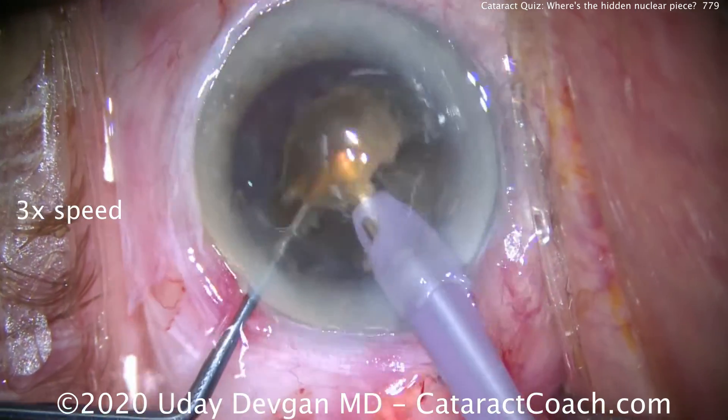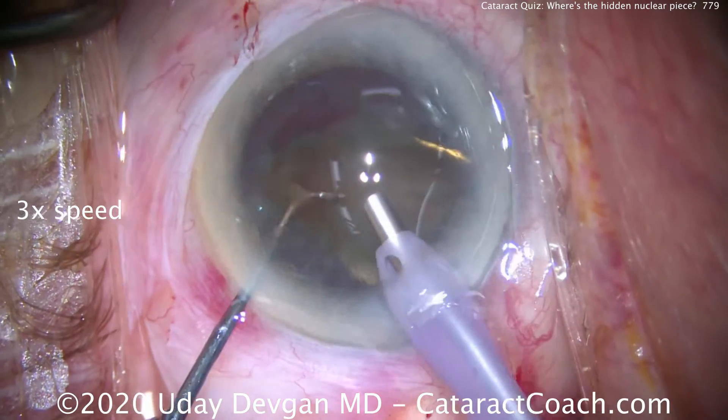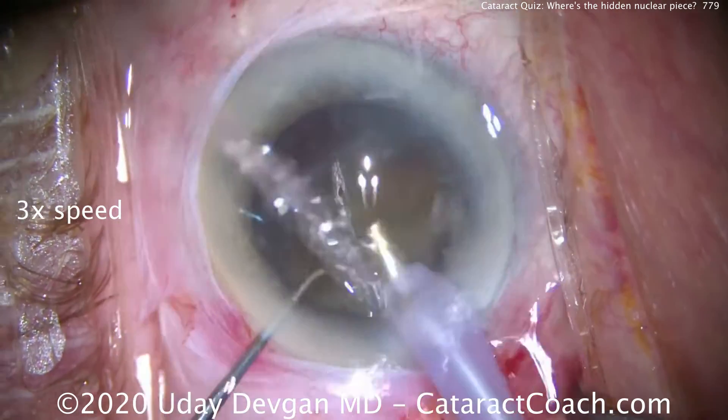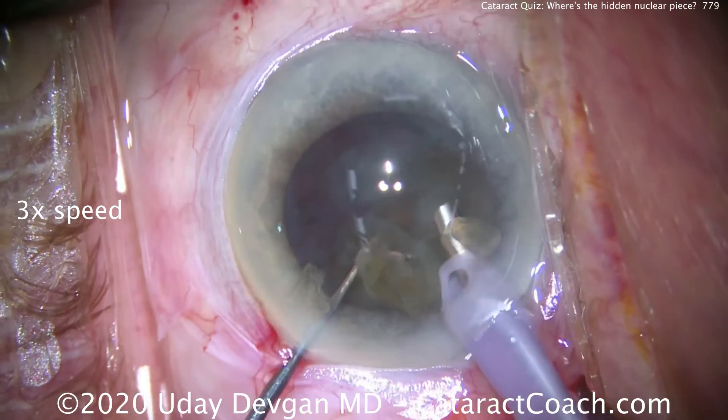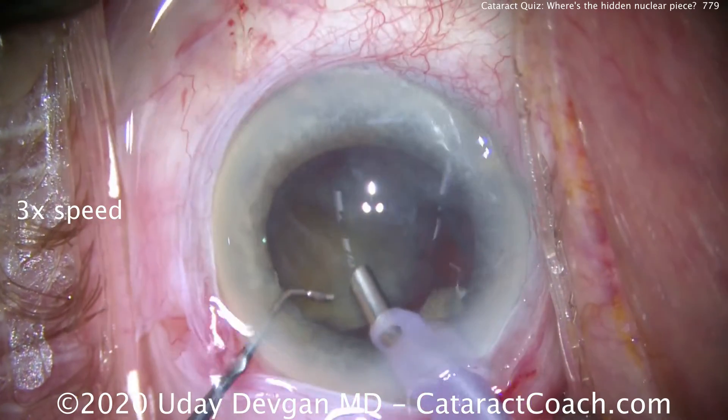Now we're going to speed up the video. This is a very dense cataract in a 96-year-old patient. I don't know why he waited this long for cataract surgery. We'll take our time to chop the nucleus into many small pieces and emulsify them with phaco power modulations.